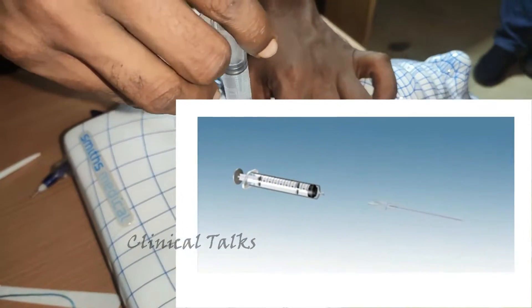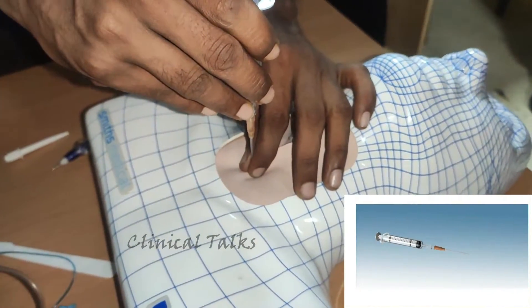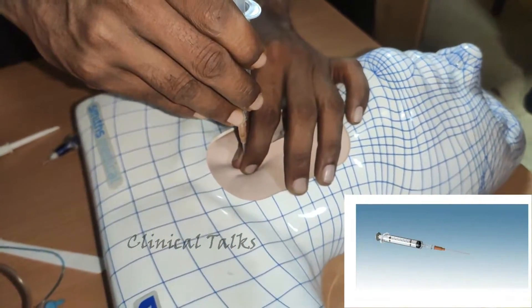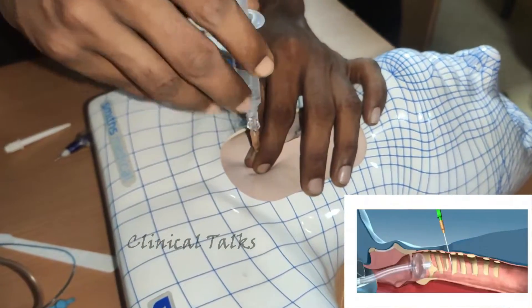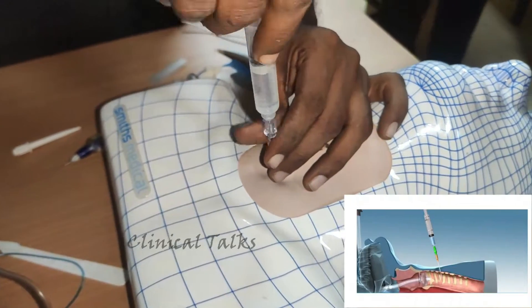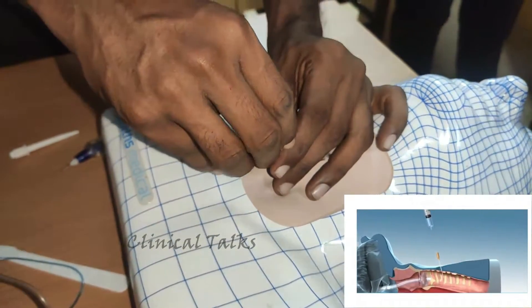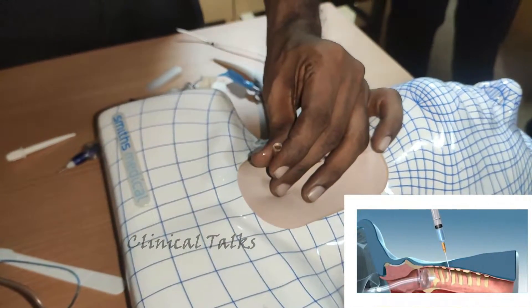Step 2. Attach the 10 mL syringe to the needle and cannula assembly. Insert the 14-gauge needle and cannula with attached saline-filled syringe caudally into the insertion site, followed by free bubbling of air into the syringe while aspirating. This confirms entry of the needle into the trachea.